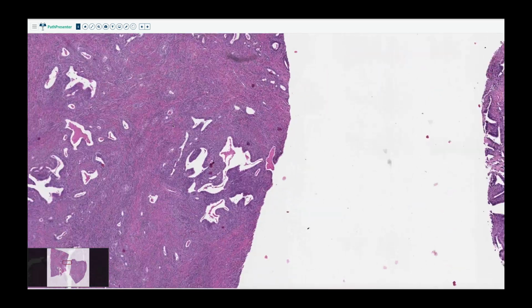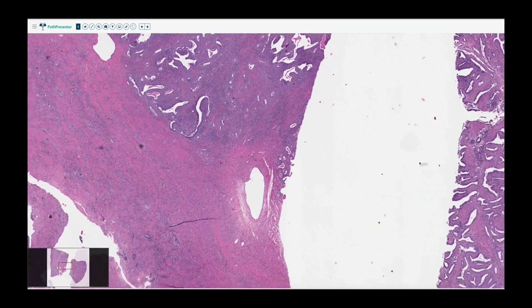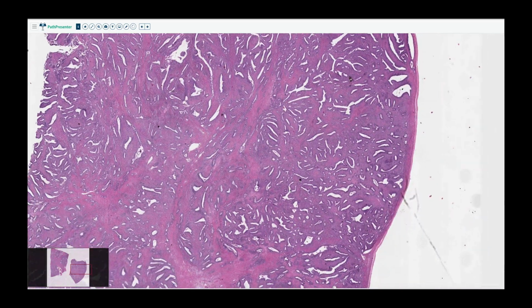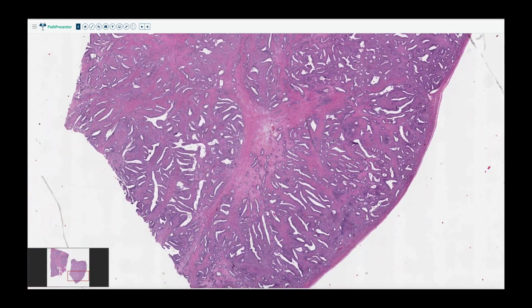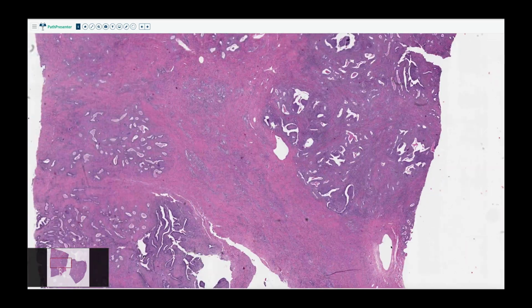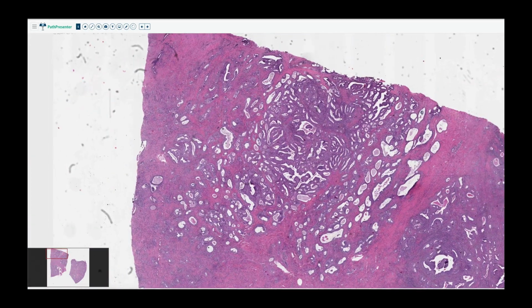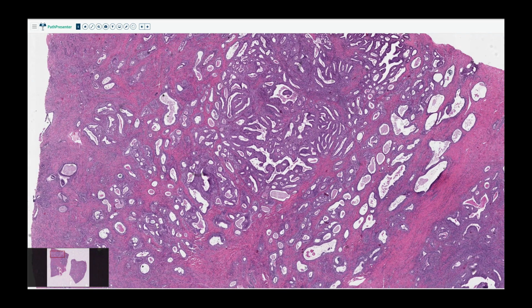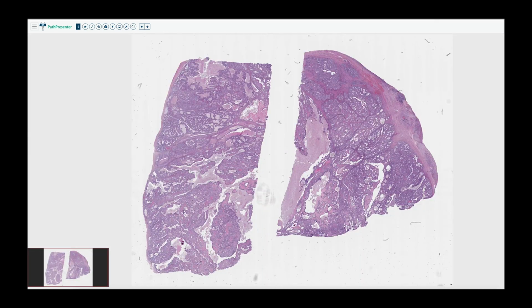Now, once you get into endometrioid adenofibroma, it can get a little bit tricky. You can start wondering, okay, is there hyperplasia here? Am I getting into endometrioid carcinoma? I can just say for right now that the spacing of these glands looks okay for endometrioid adenofibroma. I don't see anything here that makes me want to call this a carcinoma. Those are more sophisticated conversations, but for right now, the adenofibroma has both fibrous stroma and glands, so adeno and fibroma. And then we'll move on to a clear-cut case of endometrioid adenocarcinoma of the ovary.